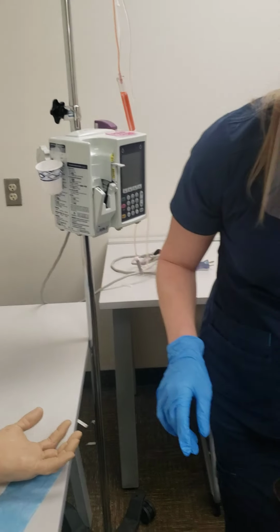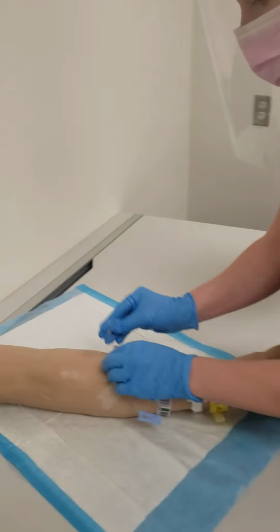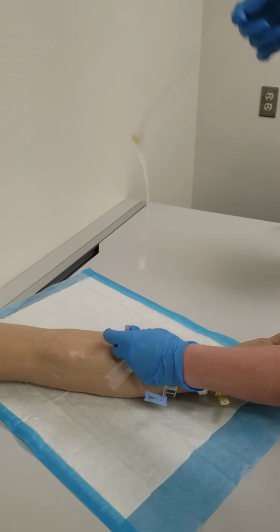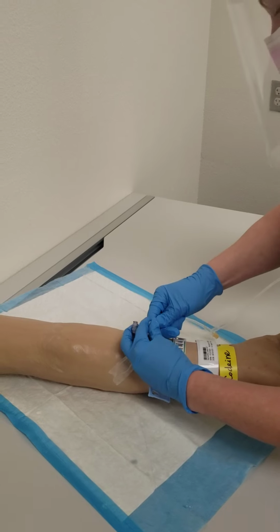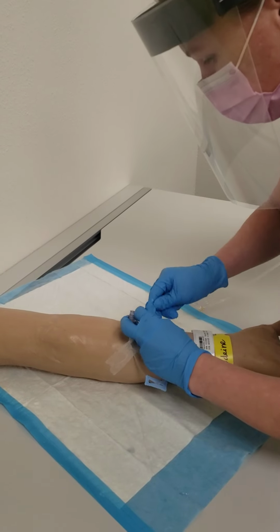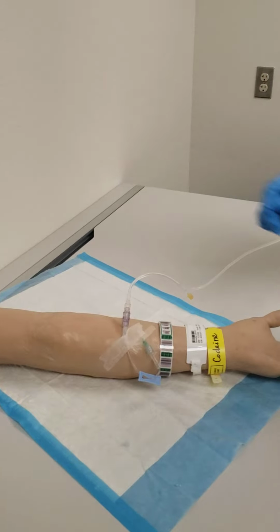Okay, so I'm just going to get my alcohol wipe ready. Let that dry. Did I close that clamp? Yes, I did. Okay, making sure that clamp's closed. Okay, I'm going to go ahead and hook that up.